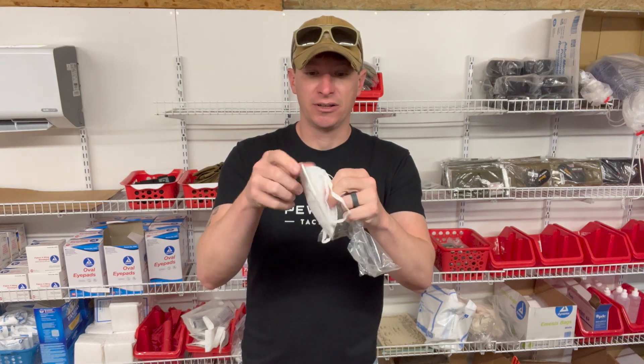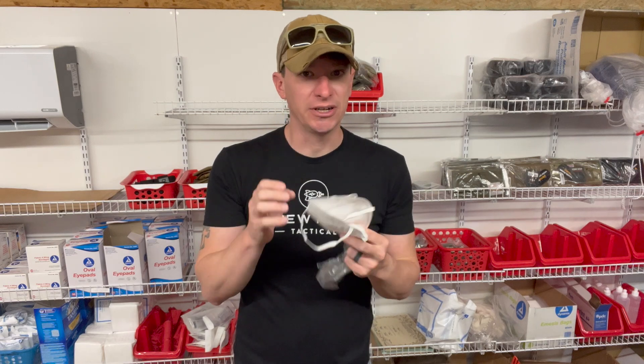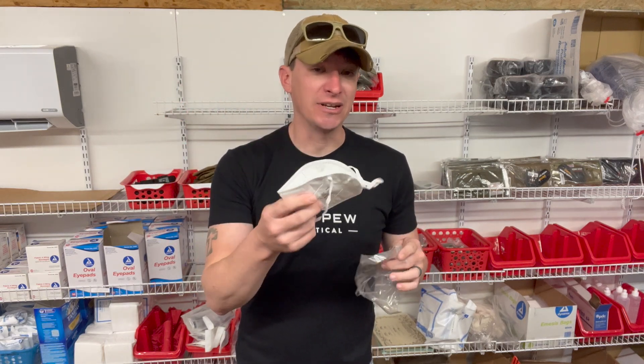These are American-made, have a little nose piece, and go over the head. Those are honestly the best way to get a good seal. The ones that go around your ears don't get a great seal, so the ones that go over your head get the best seal.